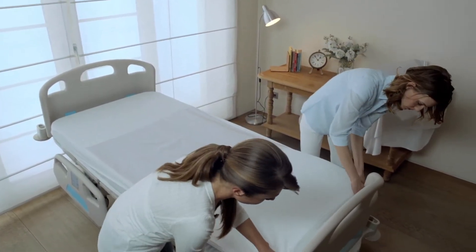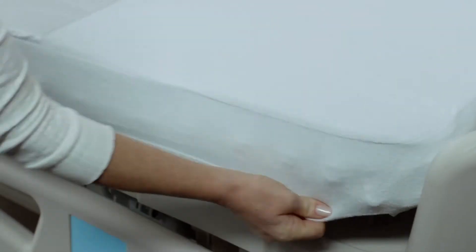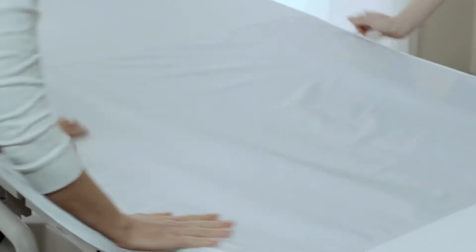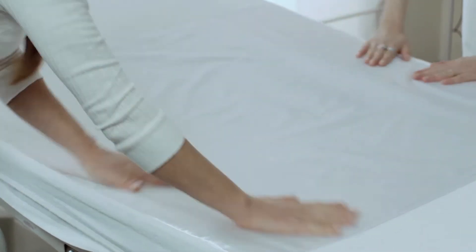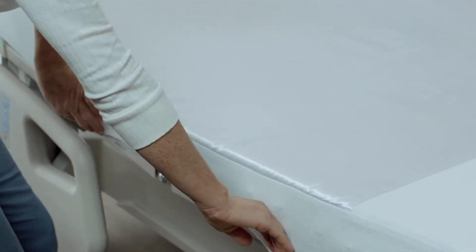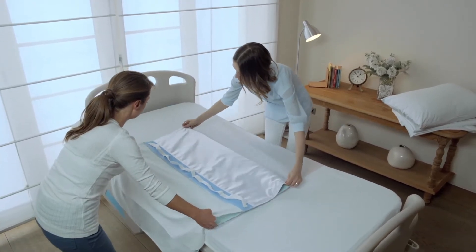AbsoSlide and CaressSlide are designed to increase safety and comfort in handling and positioning patients. With its friction-reducing satin surface, CaressSlide becomes a perfect patient transfer product when used together with AbsoSlide. AbsoSlide is a patient transfer aid with all the benefits of a washable, reusable underpad combined in one product.